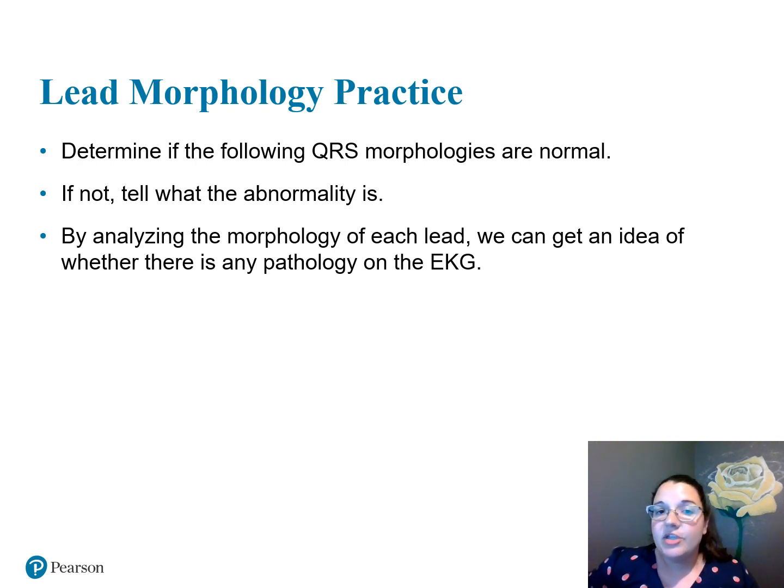So let's go ahead and practice. We're going to determine if the QRS morphologies are normal. If they are not, what is their abnormality? And by analyzing the morphology of each lead, we can get an idea of whether there's any pathology on the EKG.